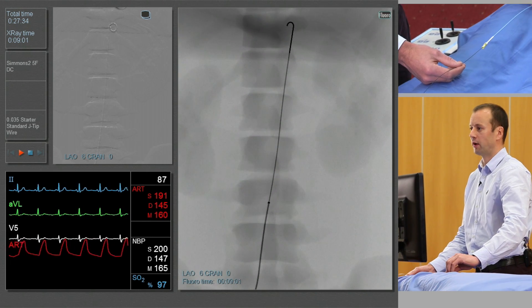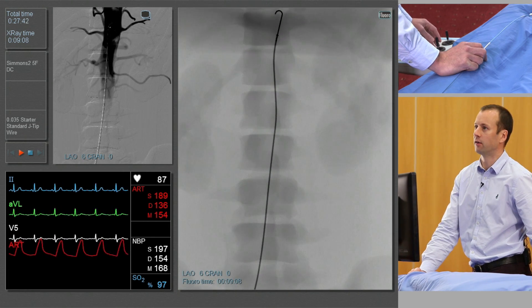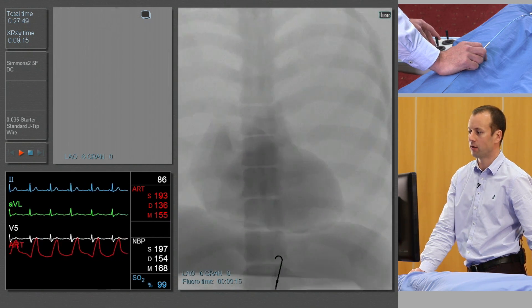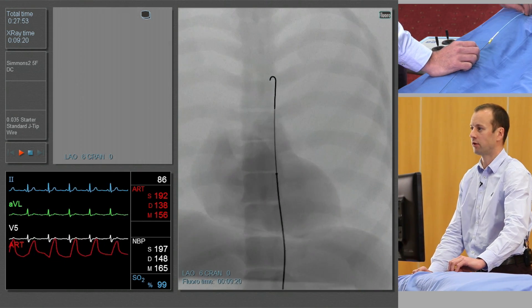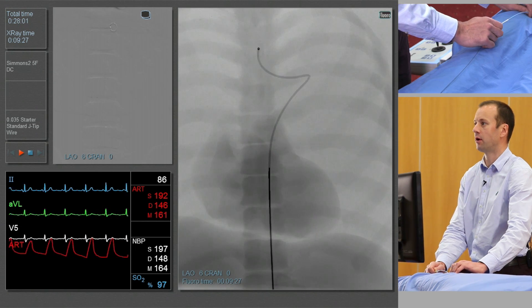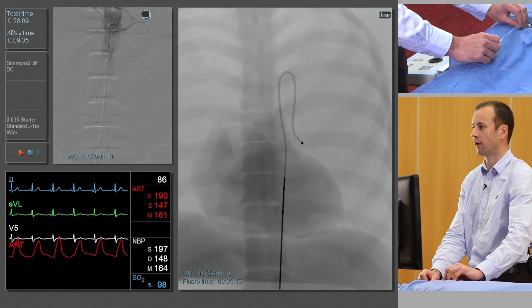Keeping the guide wire still, we'll insert the sidewinder catheter. This particular configuration of catheter needs to be reshaped and turned into the reverse-curve configuration. We typically do that either in the origin of the left subclavian artery or in the aortic arch. So we'll take the catheter up to the arch over the guide wire, remove the guide wire, and then push forwards and rotate anti-clockwise. Then pull it back down and you can see the shape that it's formed.